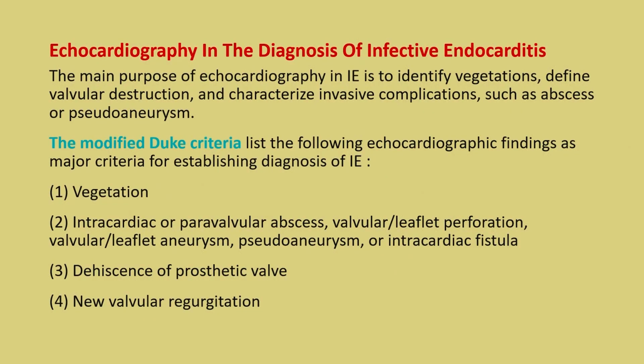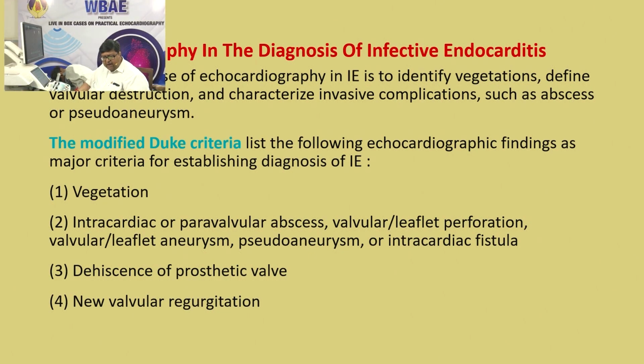So finally, I conclude this session by re-emphasizing the importance of echocardiography in the diagnosis and follow-up management of infective endocarditis. The main purpose of echocardiography in infective endocarditis is to identify the vegetations, define valvular destruction, and characterize invasive complications if present, like abscess or pseudoaneurysm.